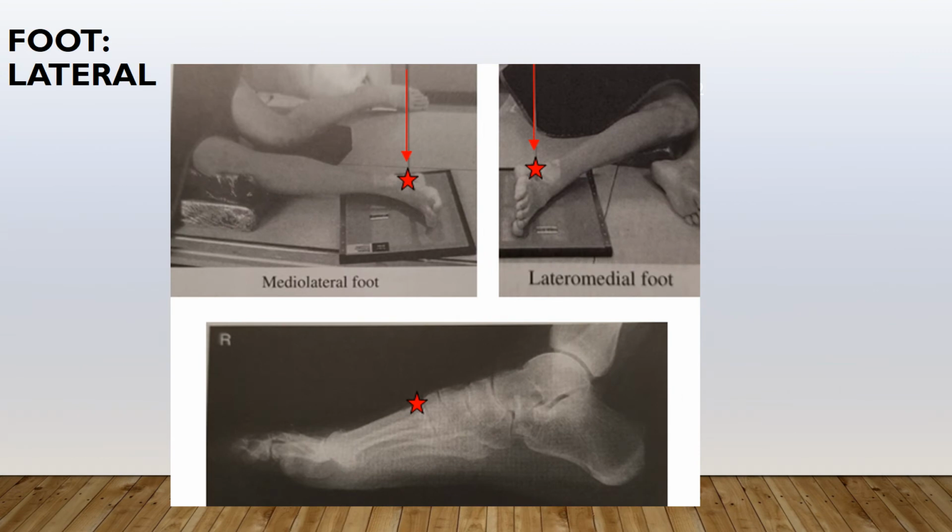Lateral foot. Once again, we need to determine if we are going to be x-raying for a podiatrist or if we are going to be x-raying for a doctor that is not a podiatrist. If we are x-raying for a doctor that is not a podiatrist, we can have the patient position lying upon the affected side.